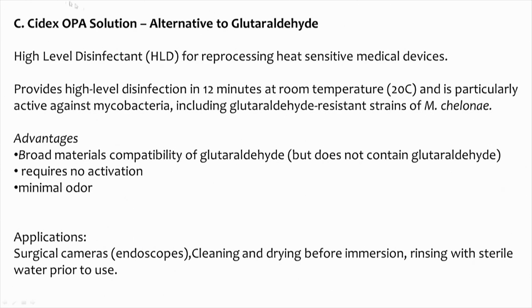Then there is another method where you are using a high level disinfectant, HLD. This is an alternative to glutaraldehyde, because glutaraldehyde also can be used as a sterilizing agent. In 12 minutes at room temperature, it is very good even for mycobacteria, including glutaraldehyde resistant ones.